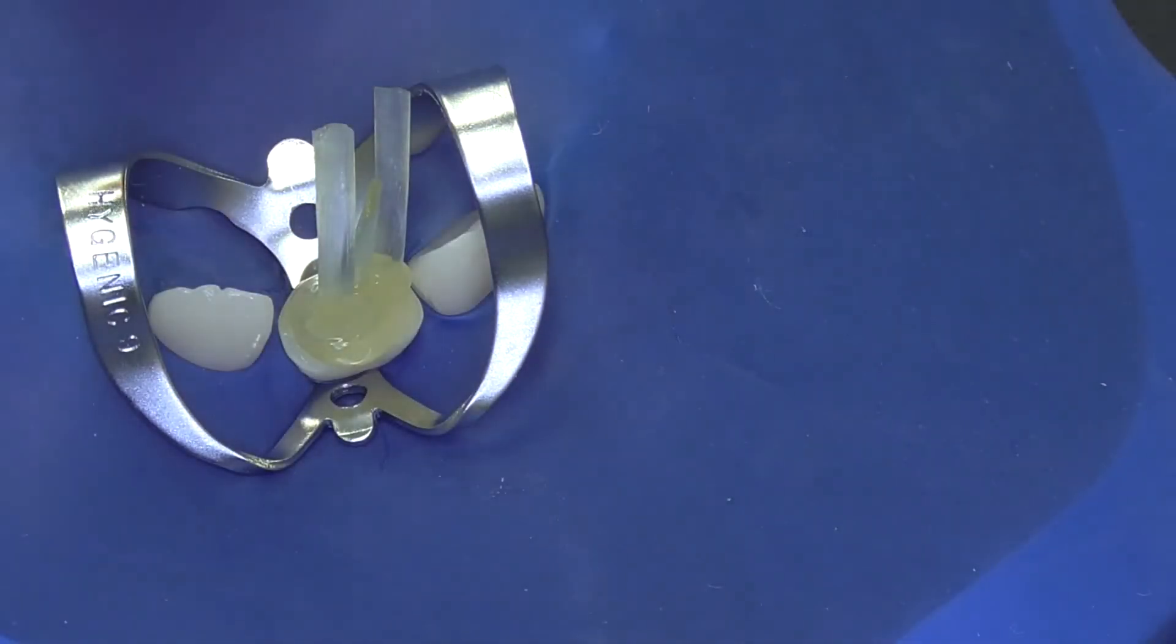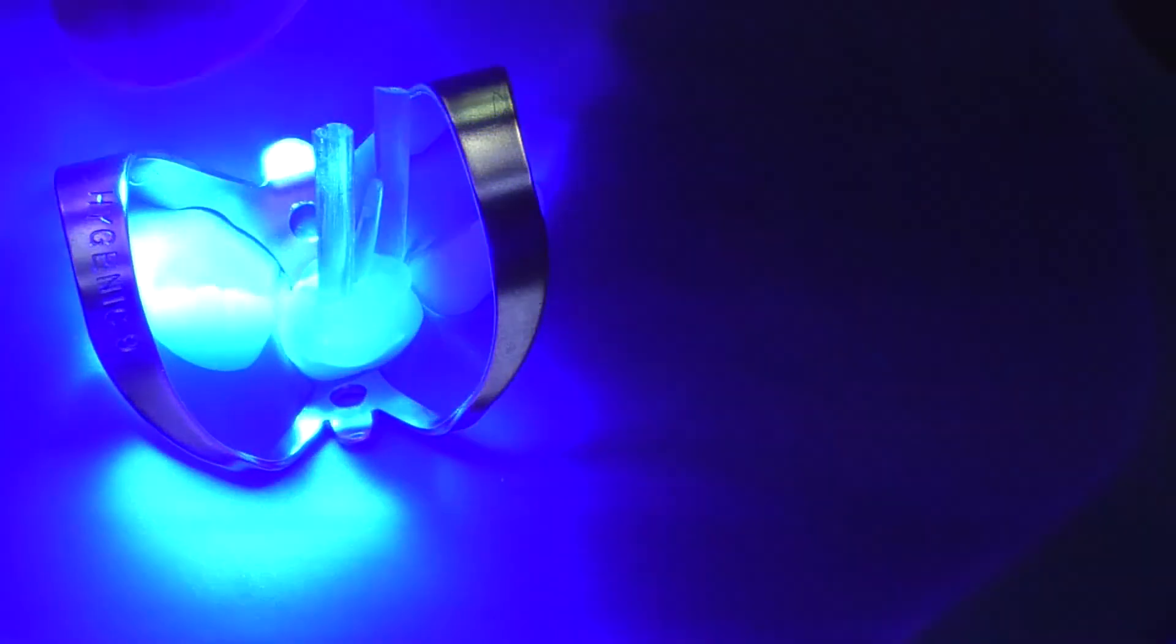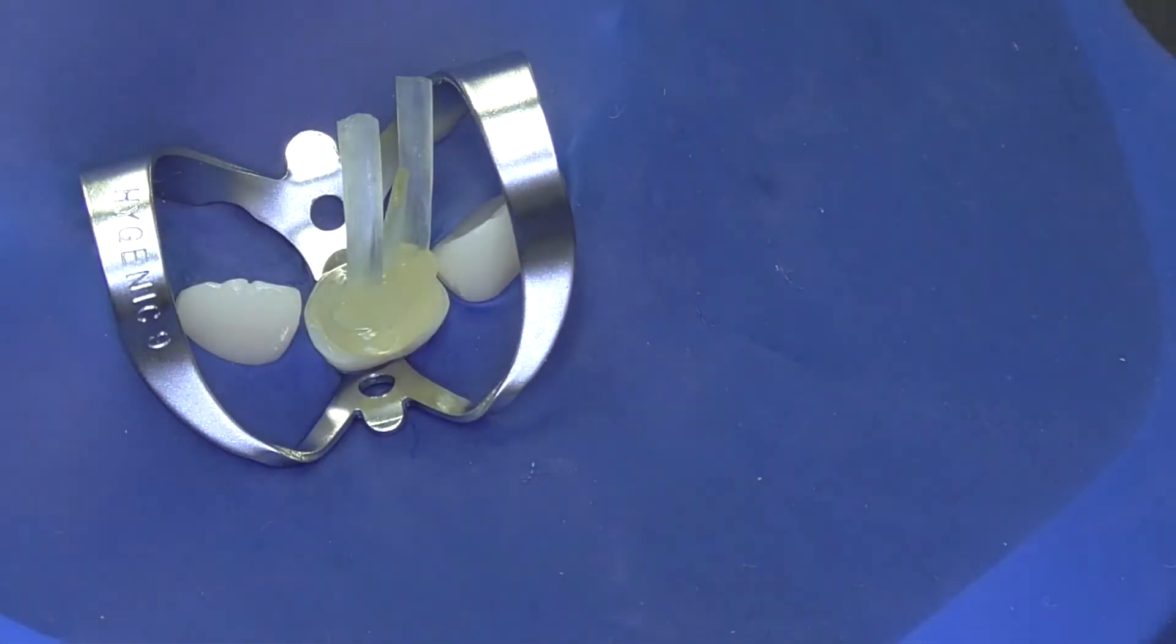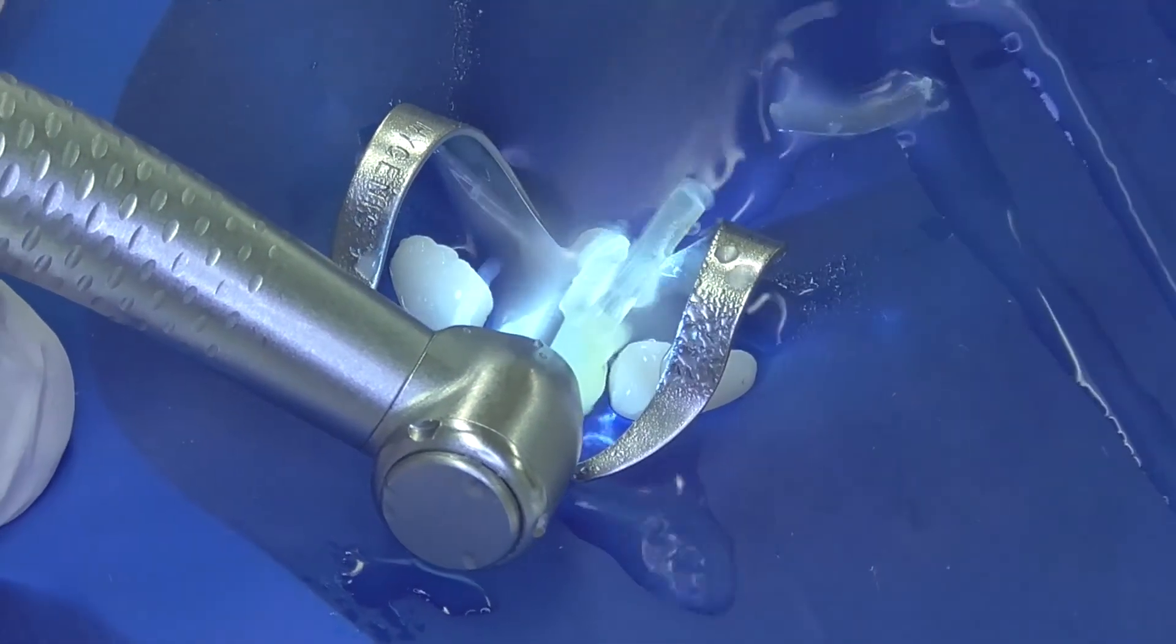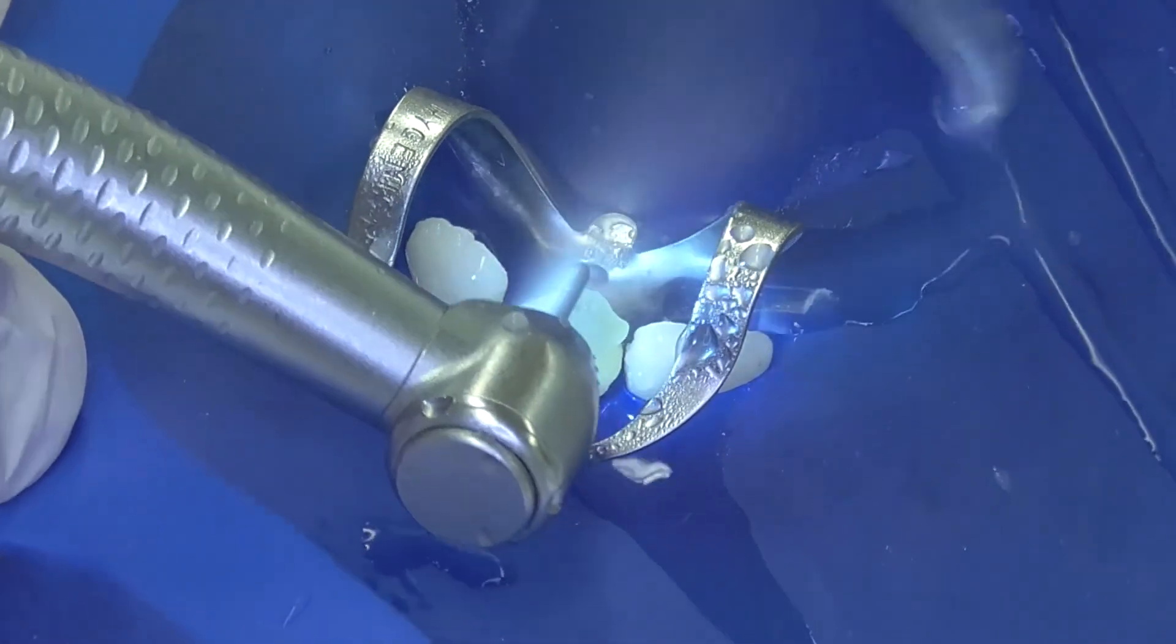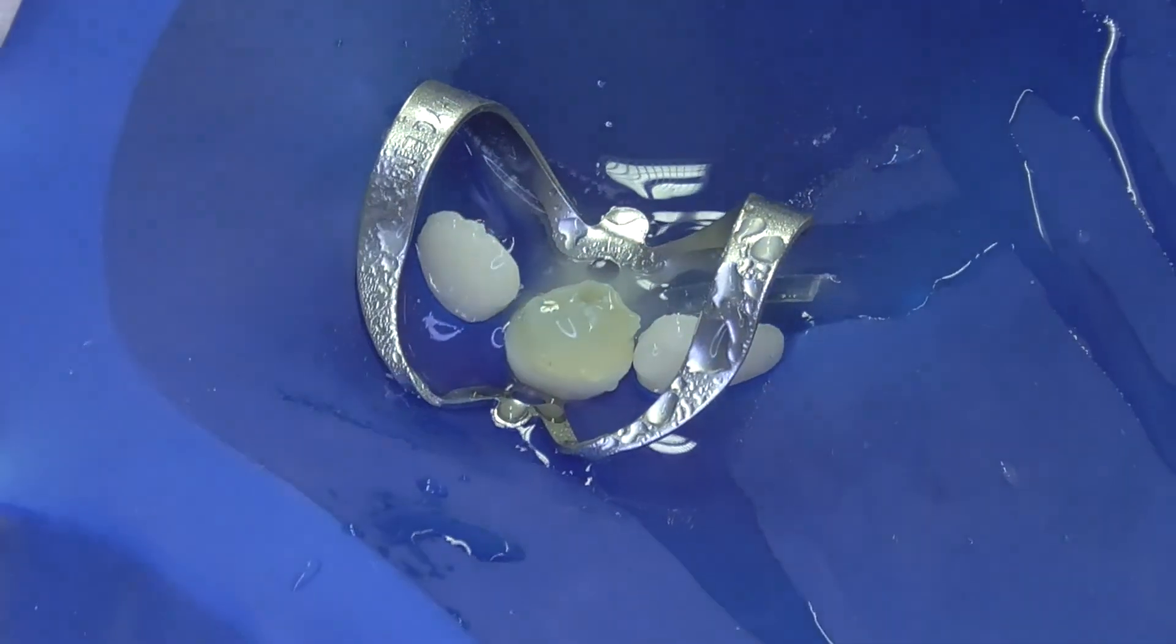Now we are curing the post through the post material, and that will be made for the second time after cutting the fiber ends with a diamond bur.